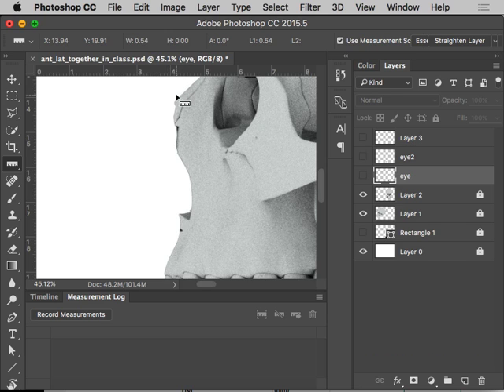So we've got the nasal bones up here, and here's the distal portion. This is not a real skull, so we have pretty straight nasals. And then the anterior nasal spine is pointing up a little bit here. I think what you'll find, and what I've always found, is that the description for measuring that tangent coming out of the anterior nasal spine is very vague. And I've seen students come up with vastly different results.